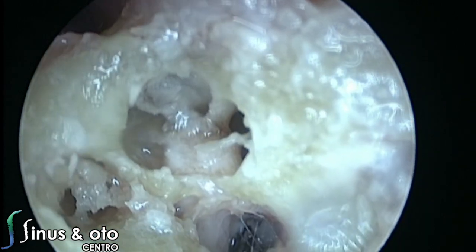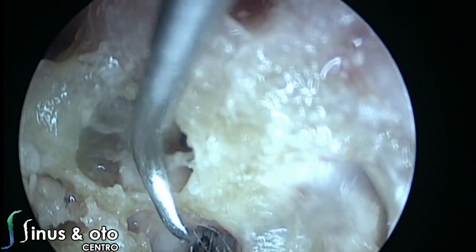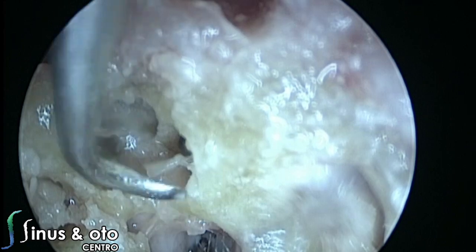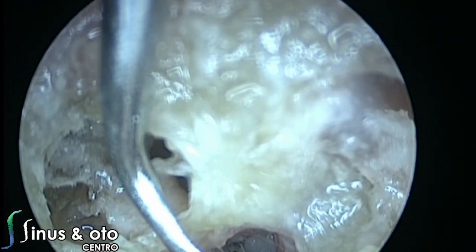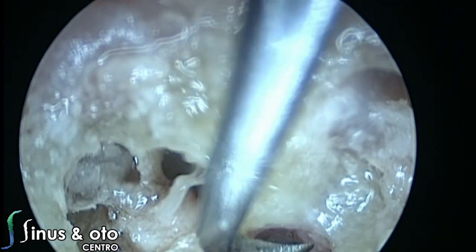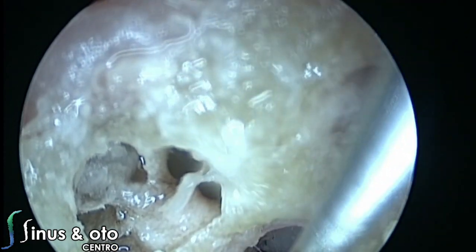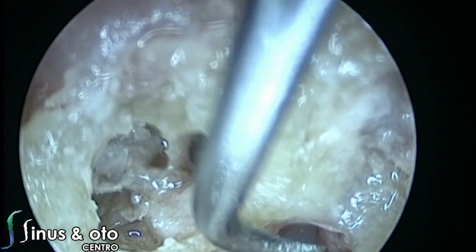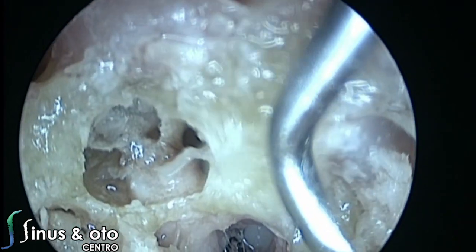In the left, going inside the modiolus, we have the cochlear nerve. Superior to the cochlear nerve and a little bit anterior, we have the facial nerve, and posterior we will have the two vestibular nerves. So we have the cochlear nerve, the two vestibular nerves, and between them we have the facial nerve in the most superior part. And then we have the facial nerve, which is that white thing, more white in the center, the vestibular nerves, and the cochlear nerve, which is more to the left of our screen.